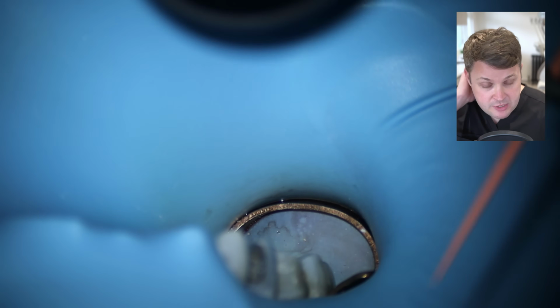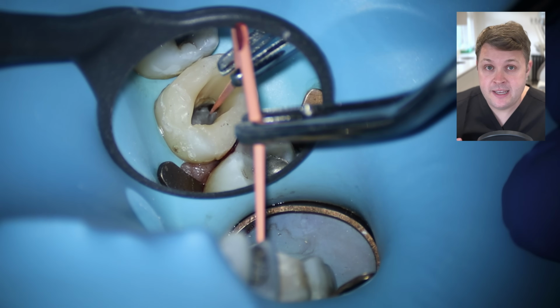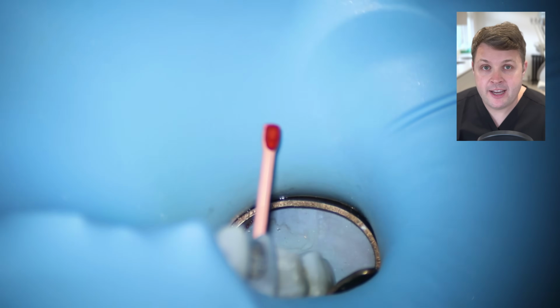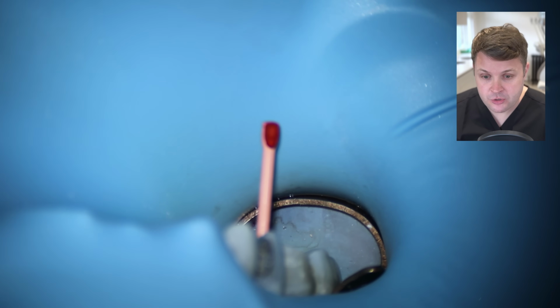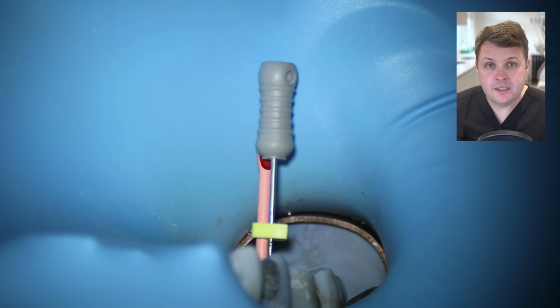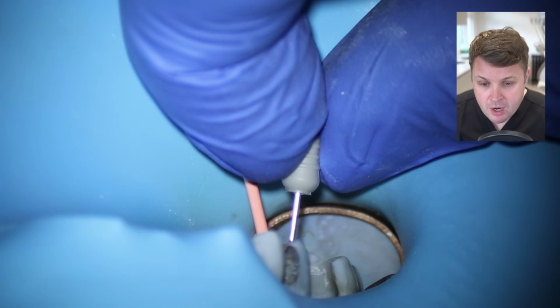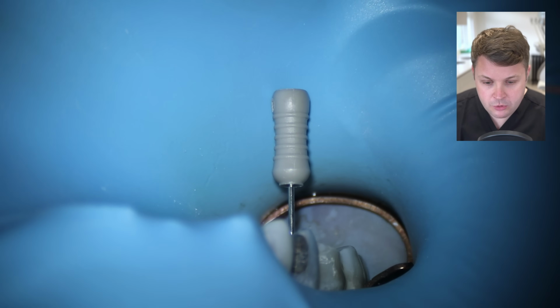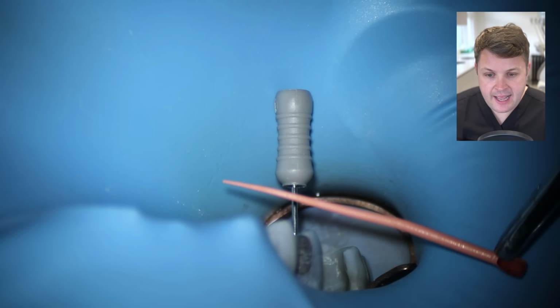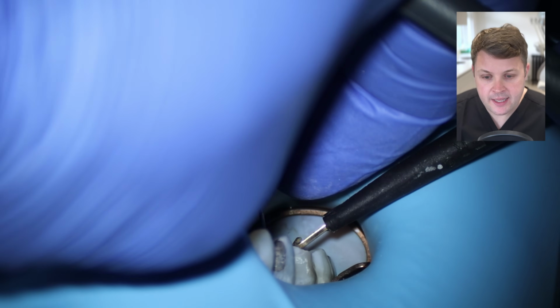And then I'm just going to use that method of placing a GP cone in the MB1, and then I'm going to use a hand file in the MB2 to see if they join, because if it does join, the MB2 will catch and mark the GP cone. But when we look at the GP cone here, there's no mark at all. So I am pretty confident that the MB2 has its own canal orifice.